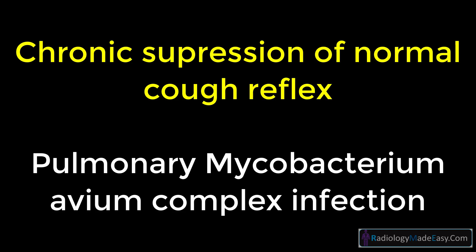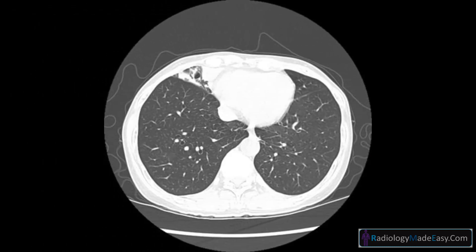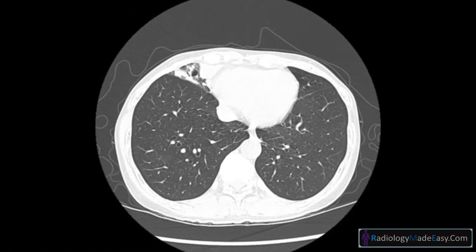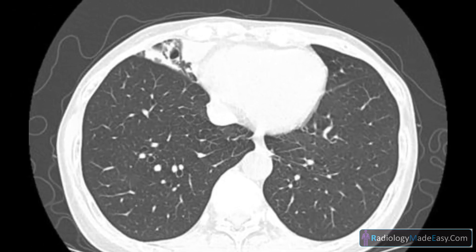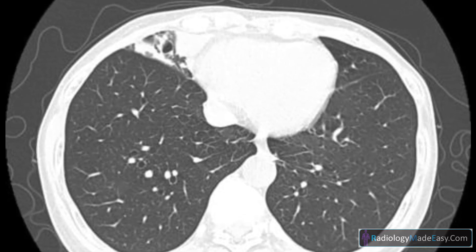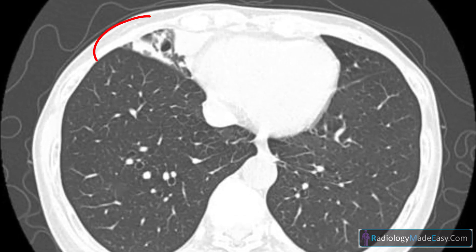Lady Windermere's syndrome occurs due to chronic suppression of the normal cough reflex, which predisposes to pulmonary Mycobacterium avium complex infection. In this HRCT axial lung window, we can clearly see the collapse of the right middle lobe.